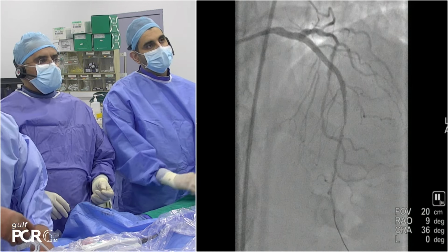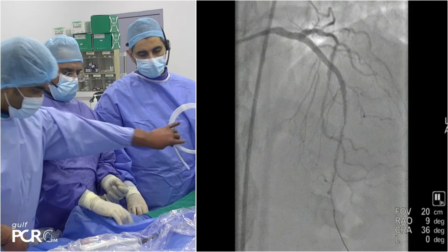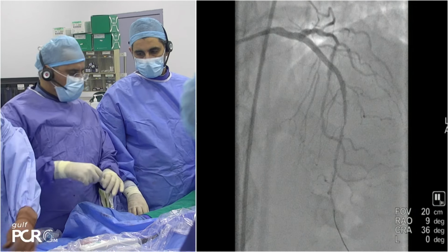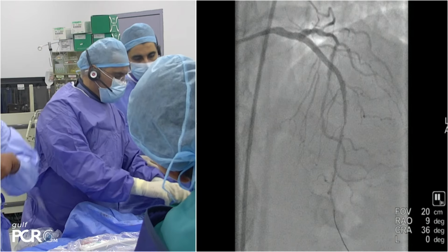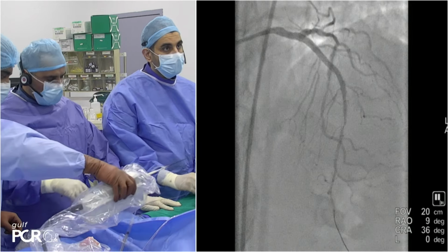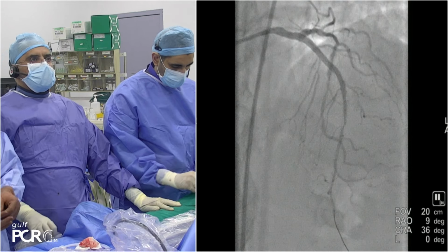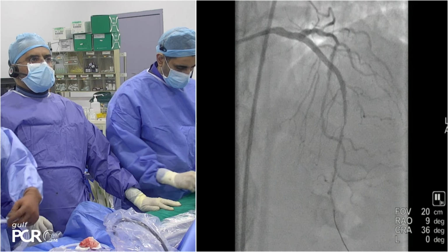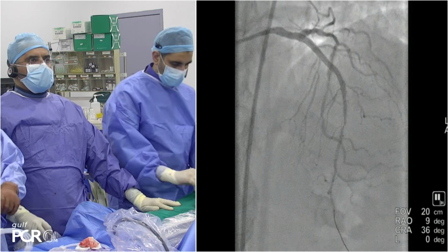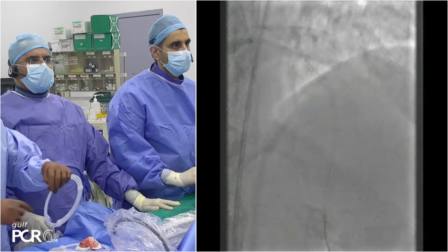So we just have to be careful. Frankly, Ibrahim, we don't want to go distally. Yeah, I was just going to say the same thing. We just have to be careful with the edge of that stent. If we're a bit too aggressive and get into a problem, there is no more landing zone to put another stent. This vessel is so diseased that we have to respect the fact that we have to stop somewhere safe. And the OCT sometimes drives us to do more, but we have to keep in mind if we get into a problem down there, it's not going to be easy to resolve it.